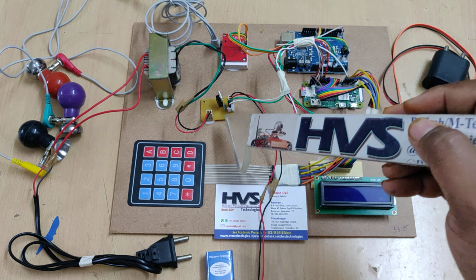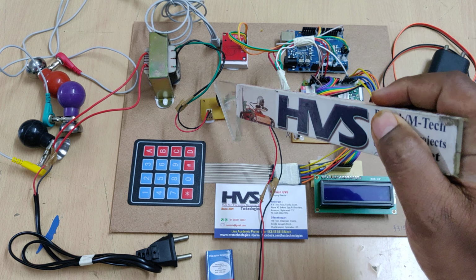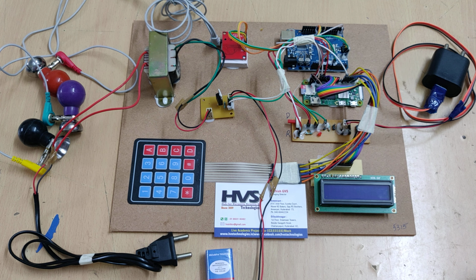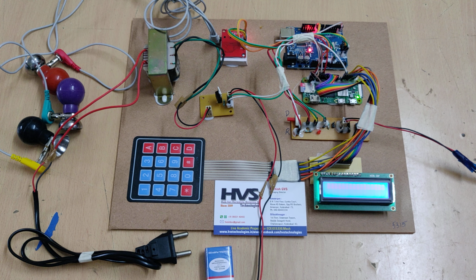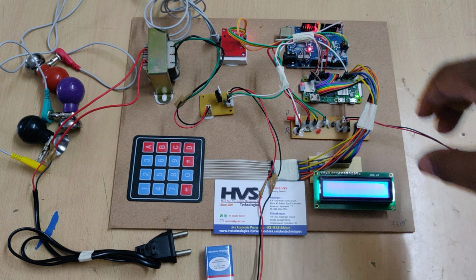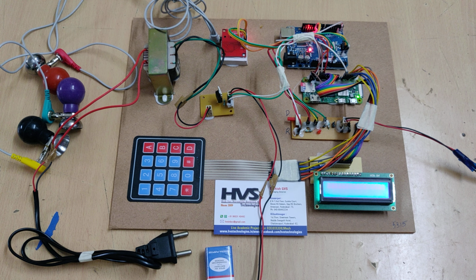And next, the MOSFET pacemaker driver board is connected to pin number 2 of our Pi Zero 2W. So let us see the demonstration. Just switch on the kit and wait; the booting will be done successfully. It will take 15 to 20 seconds maximum. Once the booting is done, let us place this in dataset mode for the demonstration purpose.